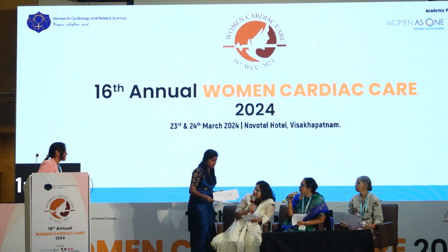Another thing is, you have done fairly well. Did you again do a flare-up in the aorta? Optimization we did again. Okay. Actually, the patient gave a lot of time to you. Yes, he didn't crash. And I have a doubt whether the patient had thrombus also, seeing the haziness. I did feel you could have used a 3.5 mm stent in the proximal part, after seeing the 3 mm LM.